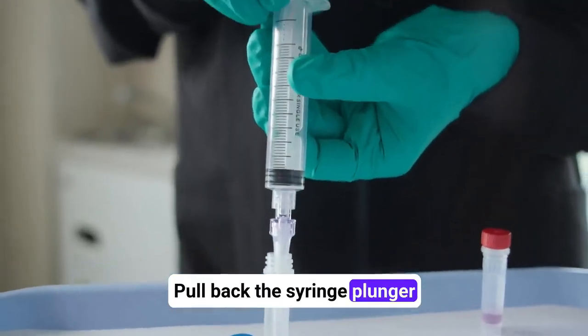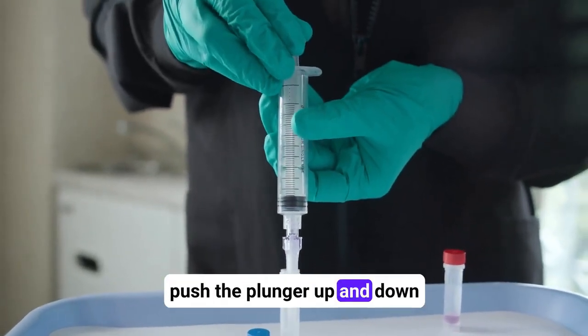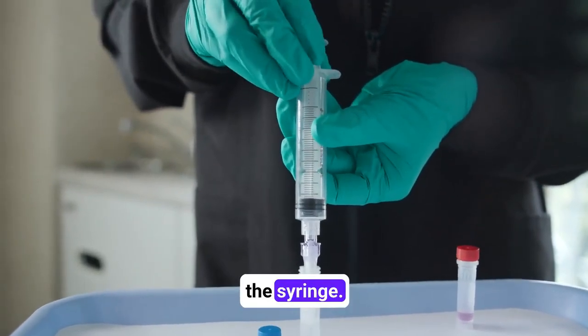Pull back the syringe plunger and draw in saline solution. Then, push the plunger up and down three times to ensure the saline has been mixed with the sample water droplets inside the syringe.